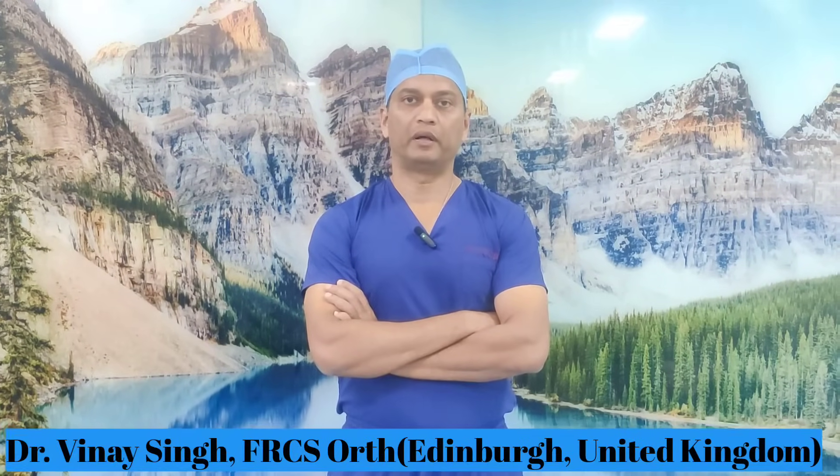Hello, today I'm going to demonstrate how to use a saw while doing a knee replacement. Knee replacement is a very common operation in orthopedics, however if you don't use the saw to make good bone cuts it can lead to adverse outcomes. I will show you how I prepare my tibia and femur before cementing them for final implantation.